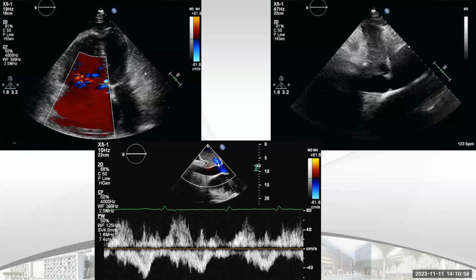As you know, in the hepatic vein, normally the flow is below the baseline. So anything here, flow is normal. Upstairs, it is flow reversal. And sometimes they may bring you just live color Doppler across the IVC and hepatic vein. Normally all the flow, in systole and diastole, goes from the hepatic vein toward the IVC, then to the orifice of the right atrium. So all the flow should be in blue color because it's going down. But if you have red, that's an indication that you have flow reversal. So you have to time with ECG, systolic or diastolic, to know the diagnosis.